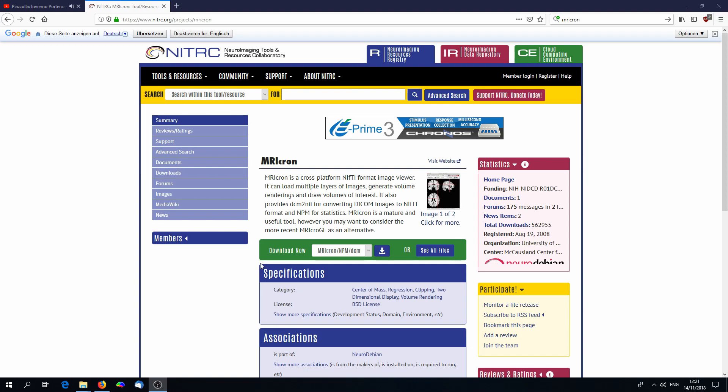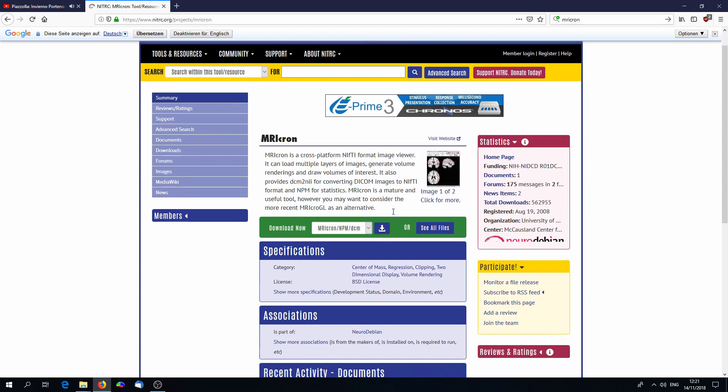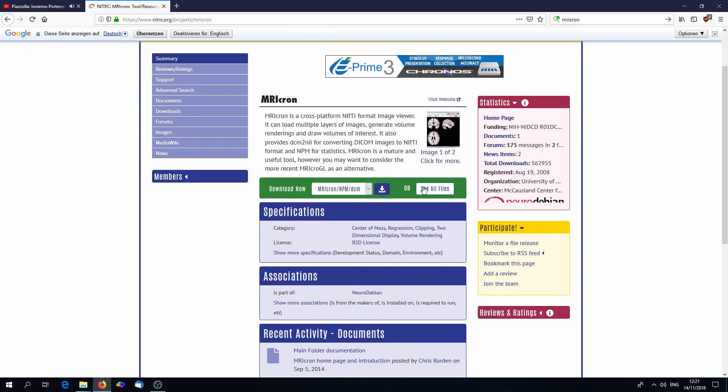Dear students, welcome to the second tutorial of lesion-to-symptom mapping. Today I'm going to show you how you perform the statistical analysis in a lesion-to-symptom analysis after you've already normalized the lesioned images.